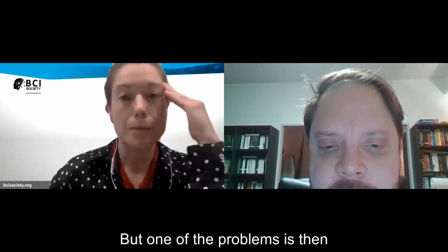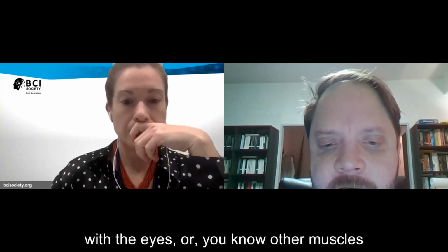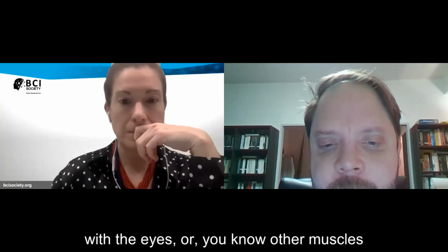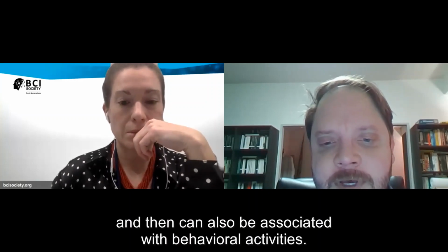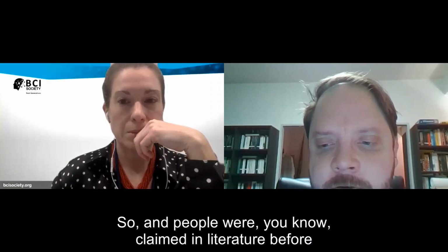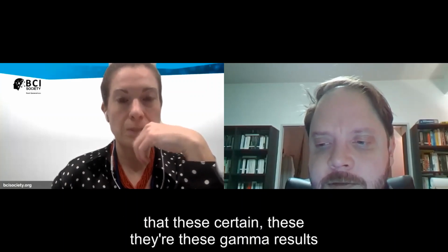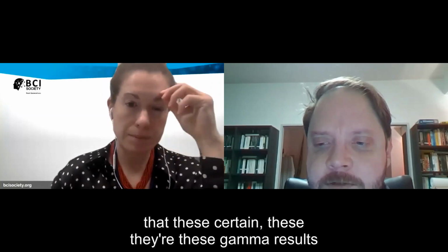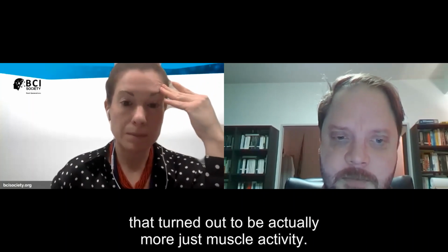But one of the problems is that you can get very high frequency muscle activity associated with the eyes, or other muscles, which could contaminate the EEG, and can also be associated with behavioral activities. People have claimed in the literature before that there are these gamma results that turned out to be actually just muscle activity.